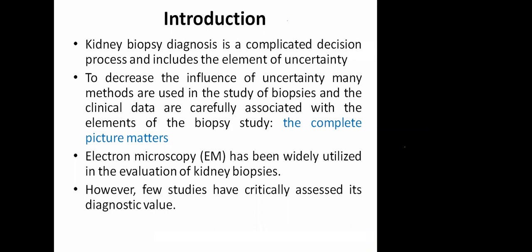If there is extensive foot process effacement, we'll say, okay, there is early diabetes, but the cause for this proteinuria is the diffuse podocytic foot process effacement. So possibly the proteinuria is because of the podocytopathy. That diagnosis is made only on electron microscopy, because LM and IF have excluded immune complex mediated disease like membranous and IgA as the cause of this massive proteinuria.